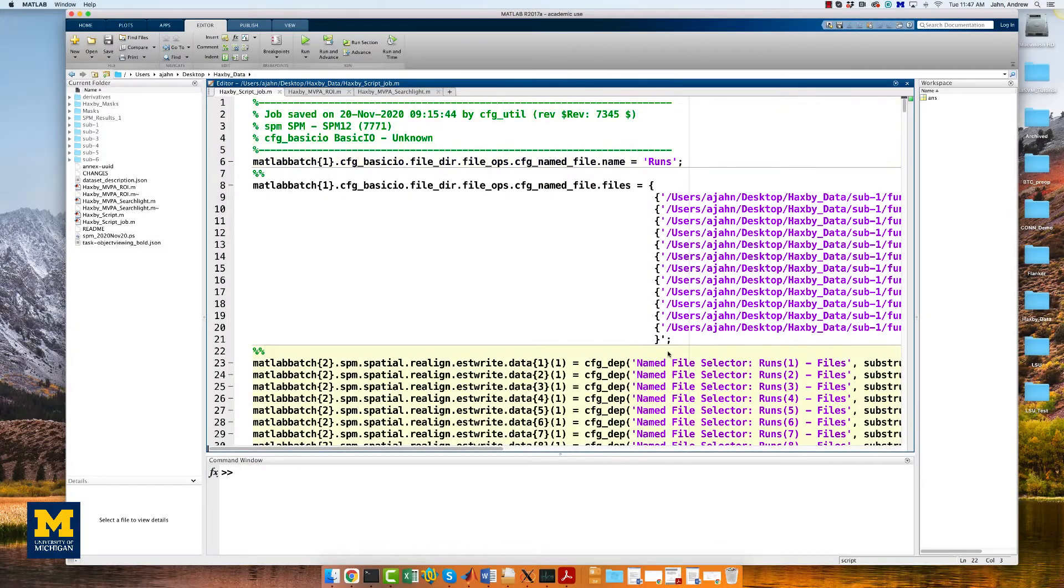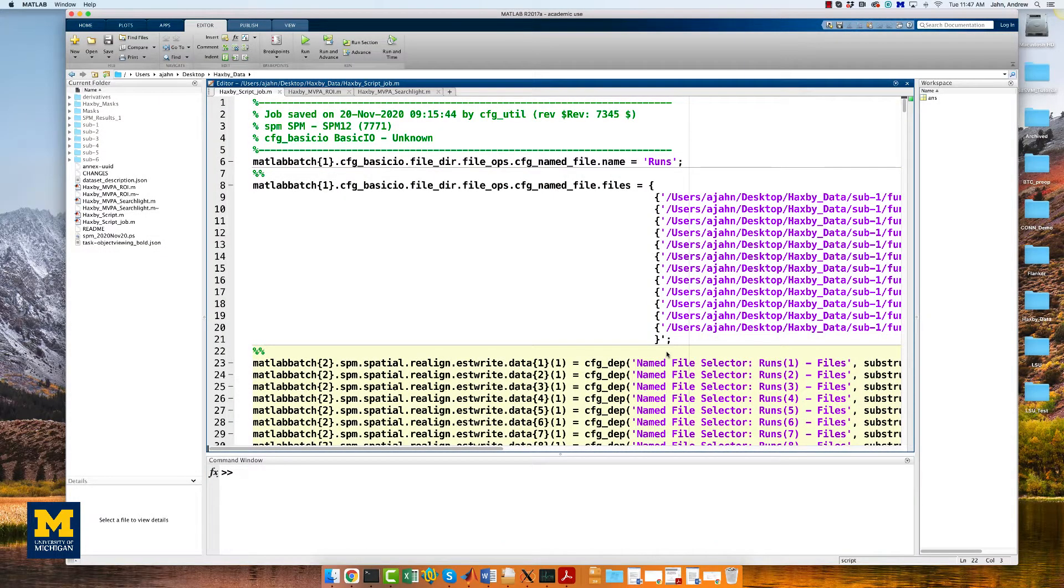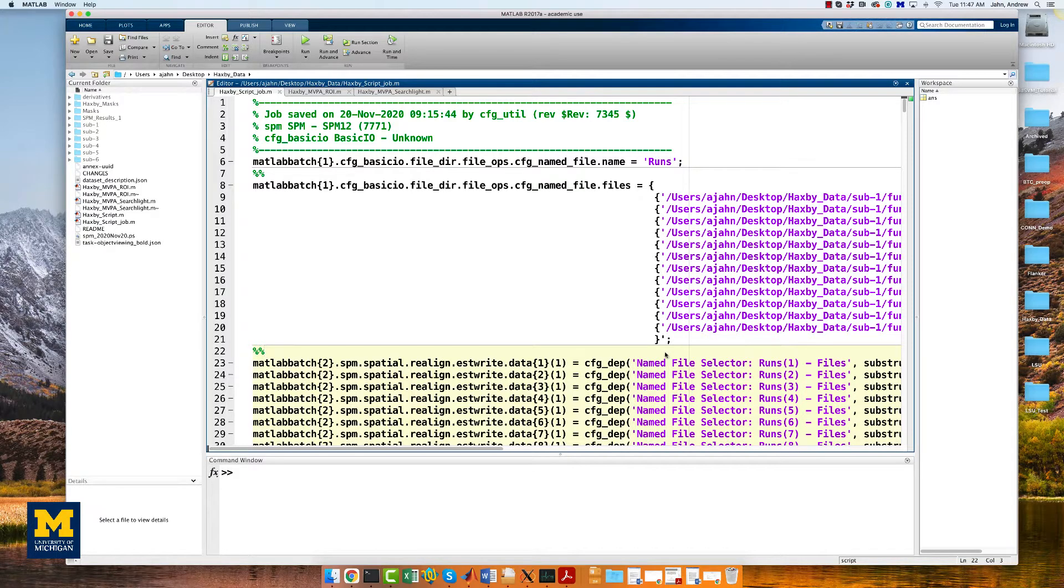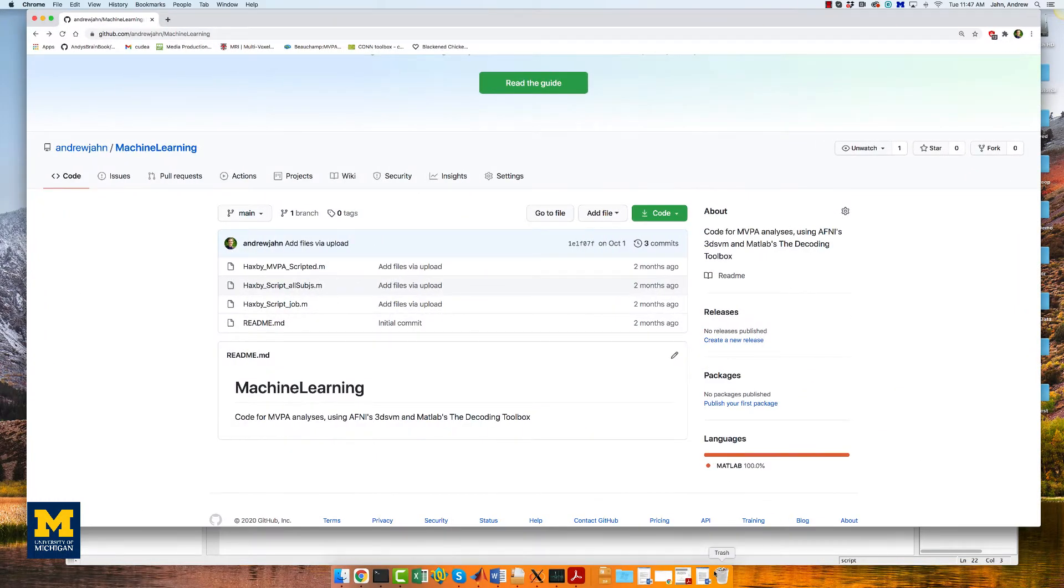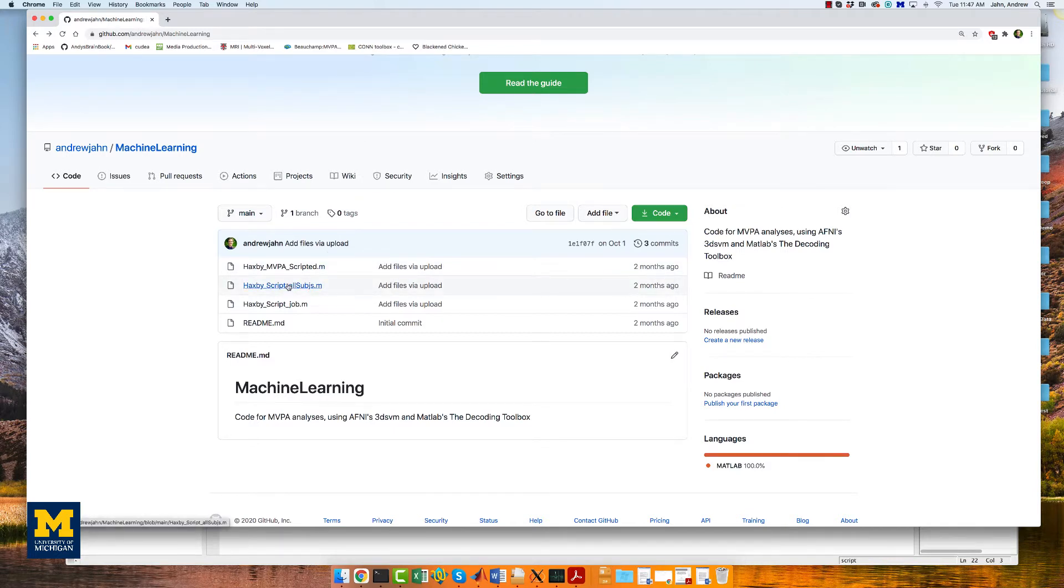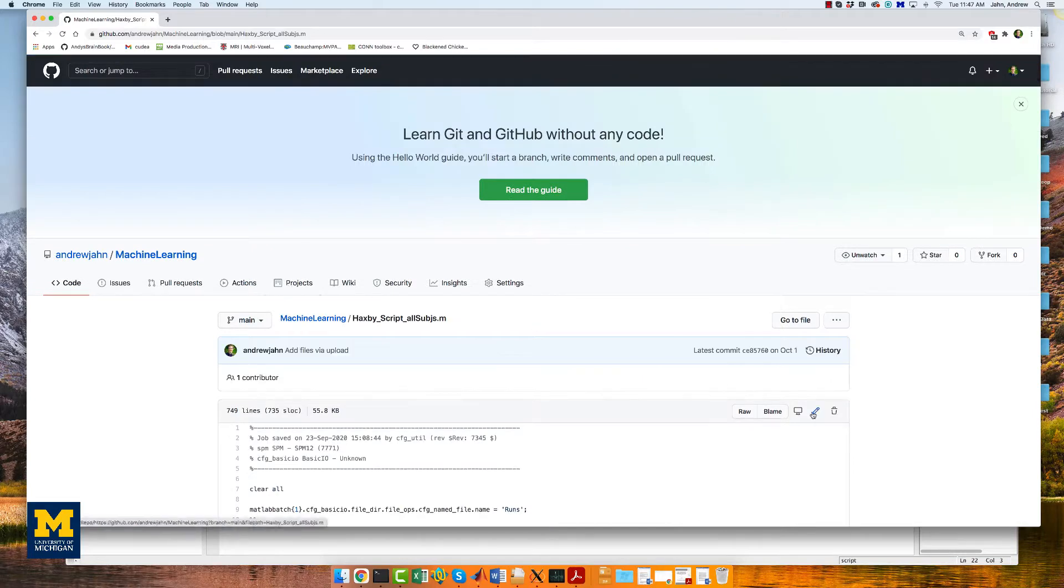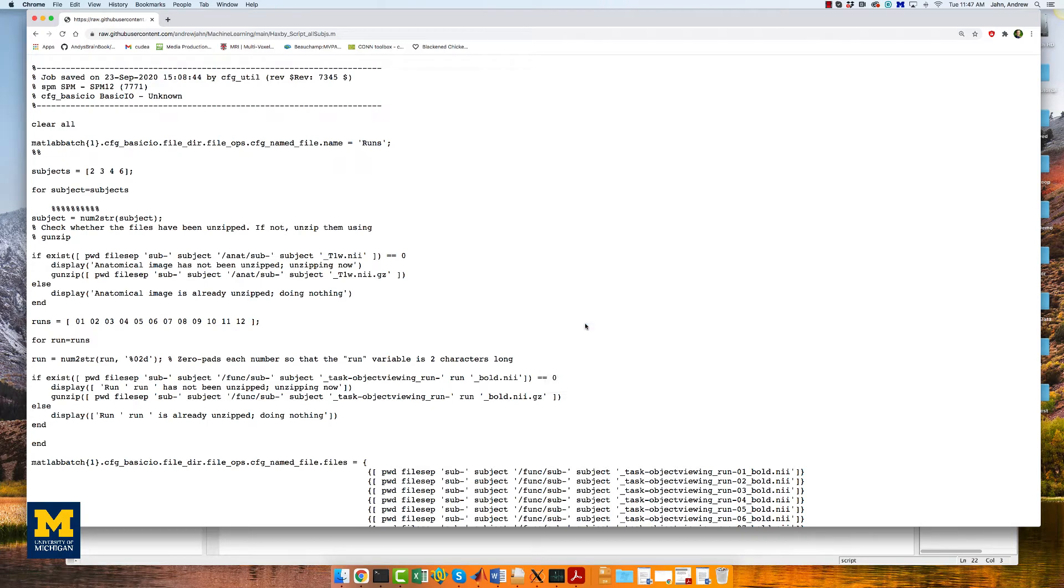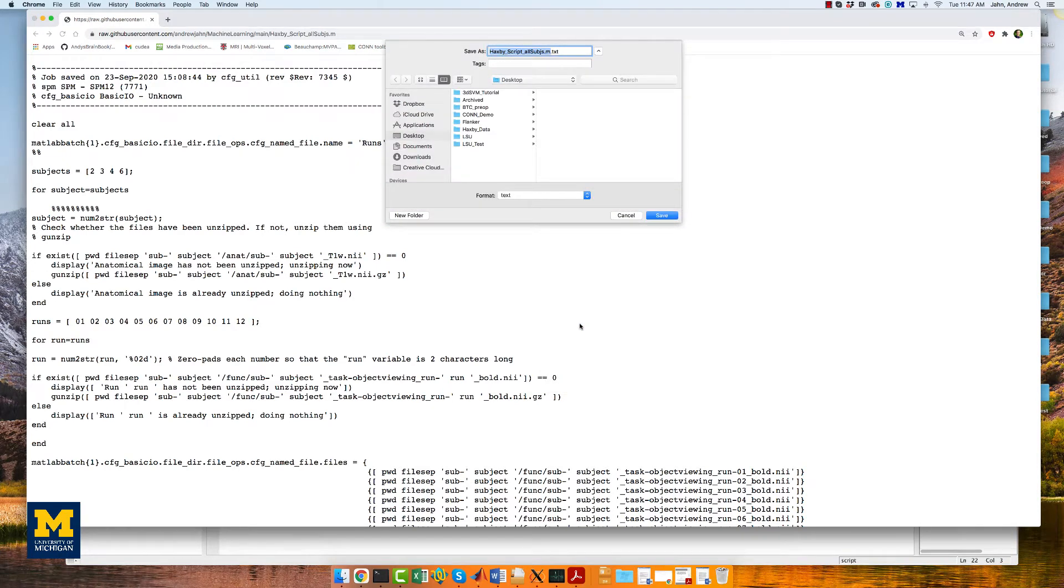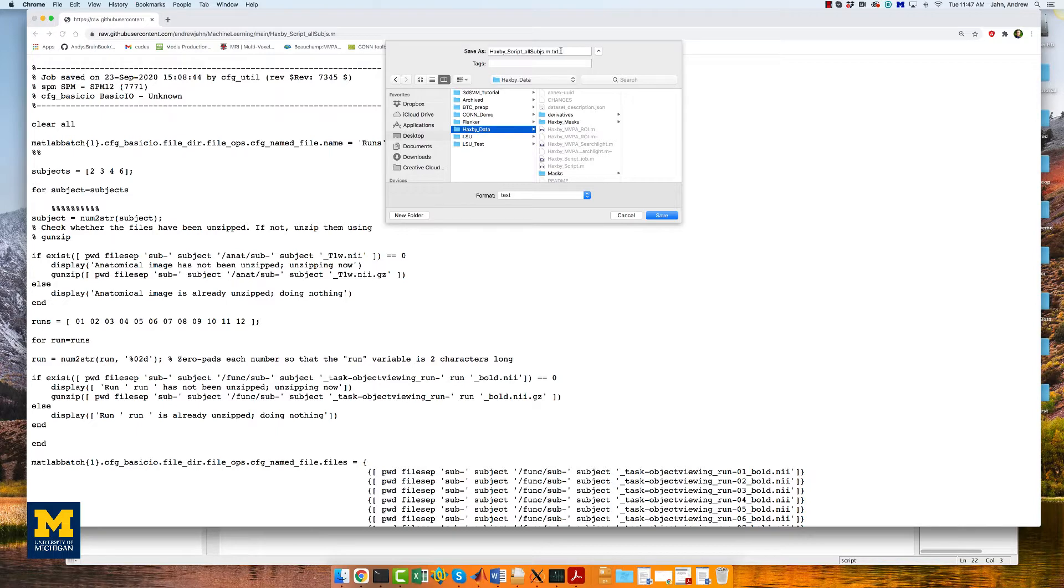The steps for modifying the script can be found in the link to the book down below. But to make this simpler for this video, we will go to the GitHub link, which is also provided below, and we will download the script, Haxby Scripted All Subjects. To download it, click on raw, right click, then click save as, and save the script in the Haxby data folder, removing the .txt at the very end.